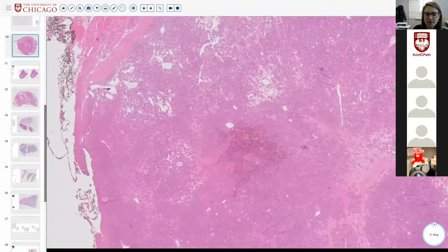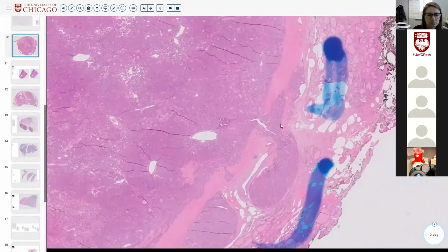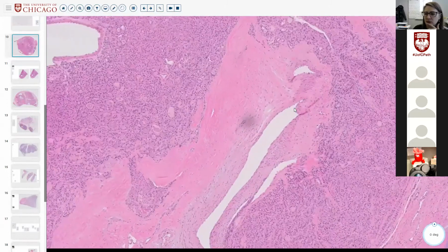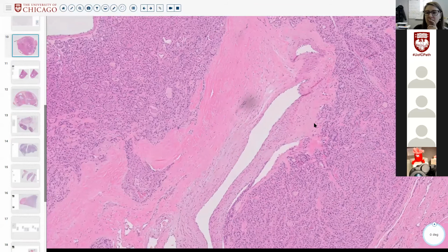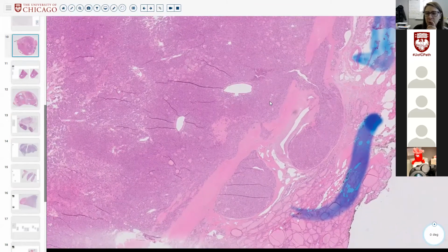And then what is the next thing we always look for? Oh, lymphovascular invasion, LVI. Angioinvasion, right? And so in thyroid, I'll just point out that lymphatic invasion is different from angioinvasion, and you should always designate which one you see, because it's behaviorally predictive.